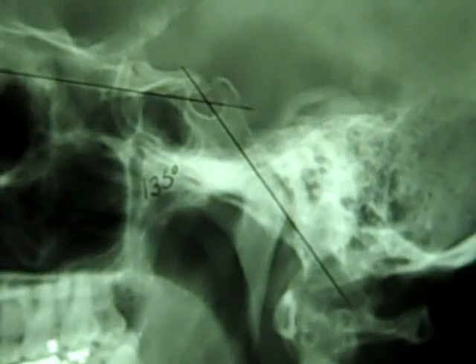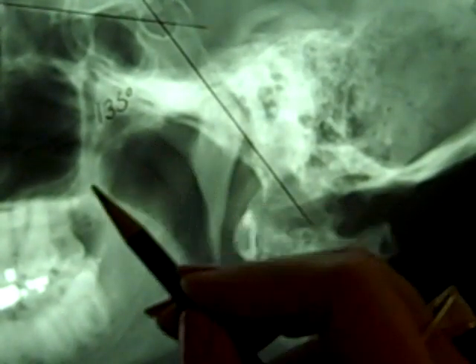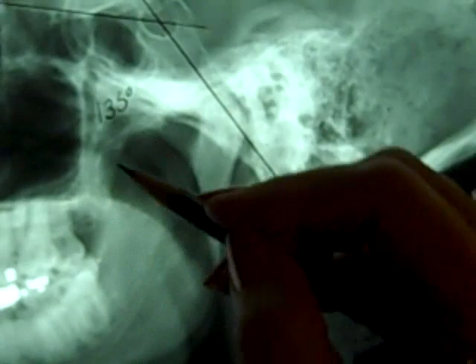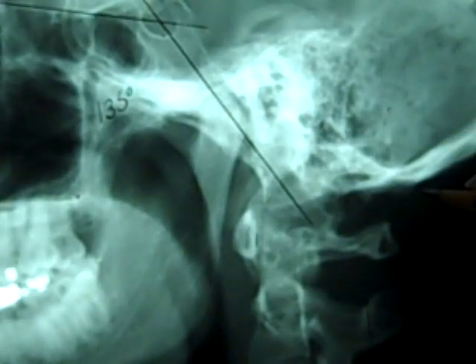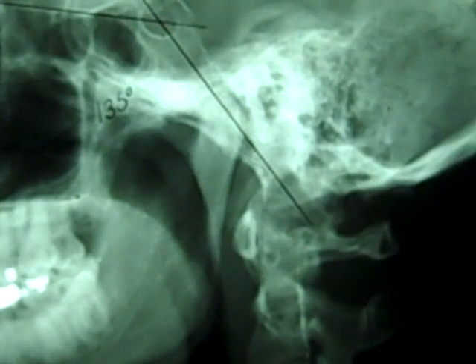Moving on, the next one is called McGregor's line. McGregor's line uses the superior posterior aspect of the hard palate. I'm going to move the camera just a little bit. That is this white density right here. So the superior posterior aspect of the hard palate would be there, to the inferior or lowest point of the occiput, which would usually be about right here, because that is running right along there.